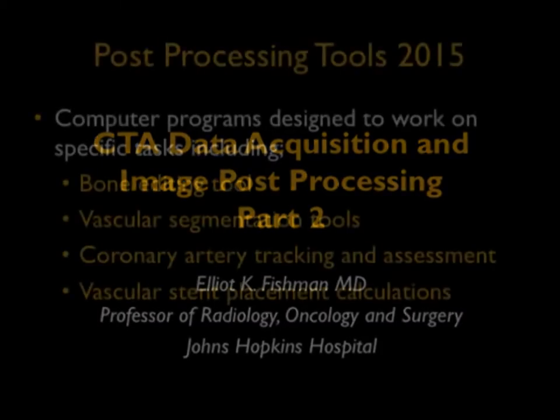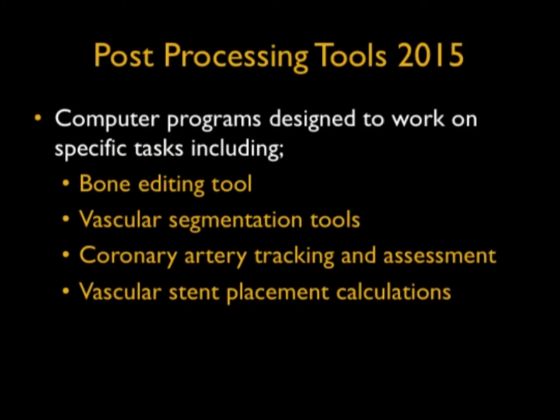And when I think about post-processing, we look at how far we've come. In the old days, which was probably like 3 years ago, you had basically one tool that you used for every function. The good news was it wasn't opening a lot of tools, and you would get very good at that tool and you could make it work. For a lot of things, I can make it work very well, but I will admit that there are other things where specific tools really make your life easier, and it makes it easier to learn and do the process. It makes it more efficient.